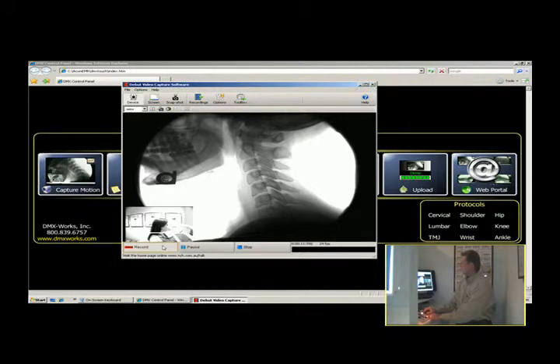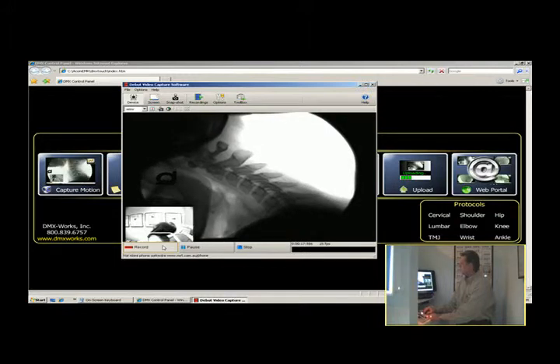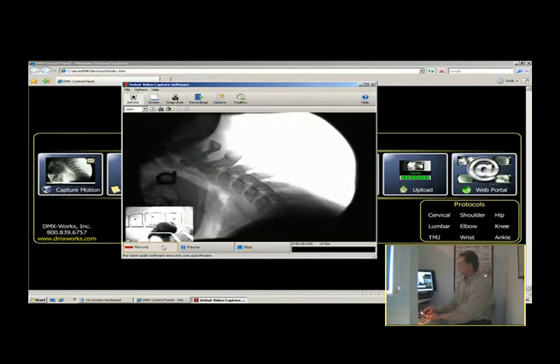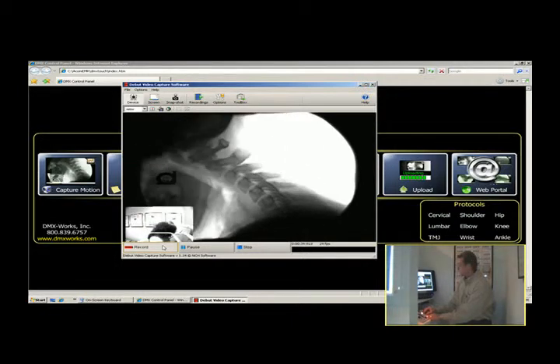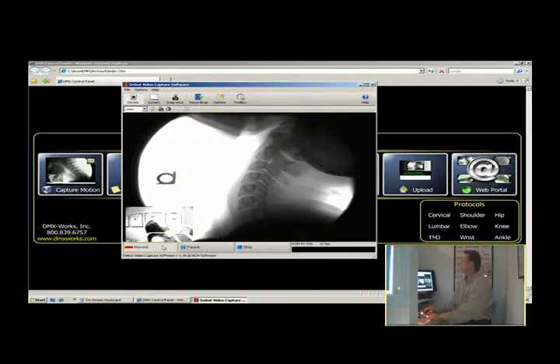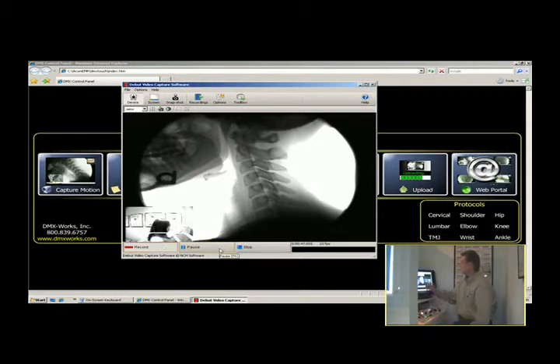Rachel, bring your head all the way down towards the floor and all the way back up towards the ceiling, and down towards the floor, all the way, and all the way back up towards the ceiling, and down towards the floor one more time, and back up one more time, all the way up towards the ceiling, and back looking straight ahead level. Good job. And it's that simple to do a flexion extension cervical DMX.